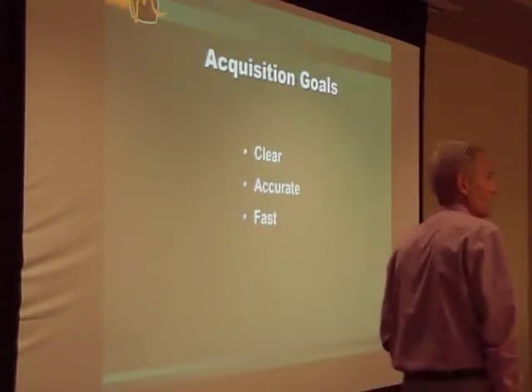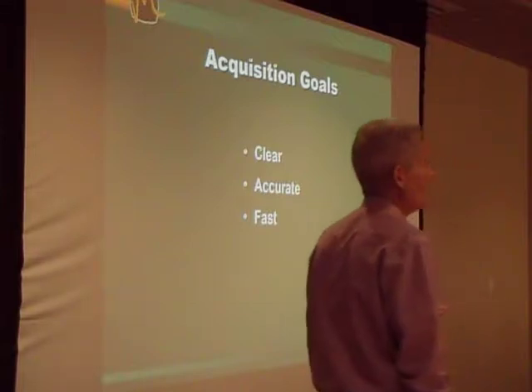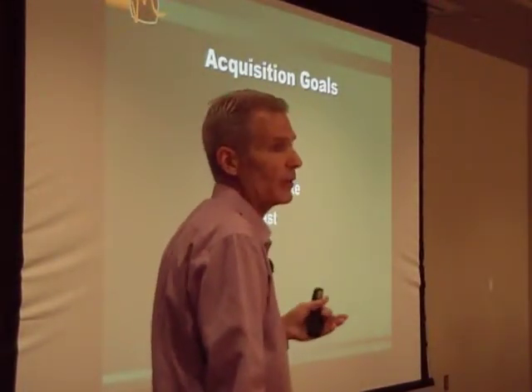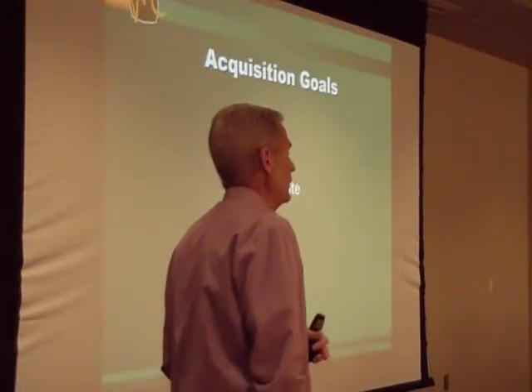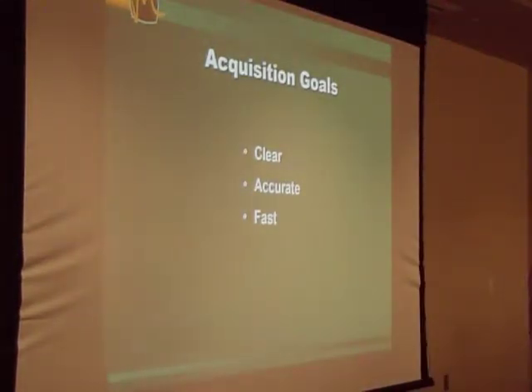But EMS systems adapted. And since we do things simultaneously, now we can acquire a 12 lead very quickly, and it hasn't affected scene time, and it actually gives you great information about your patient. So it can be done, and most of you are already familiar with it because you've been doing it since day one.